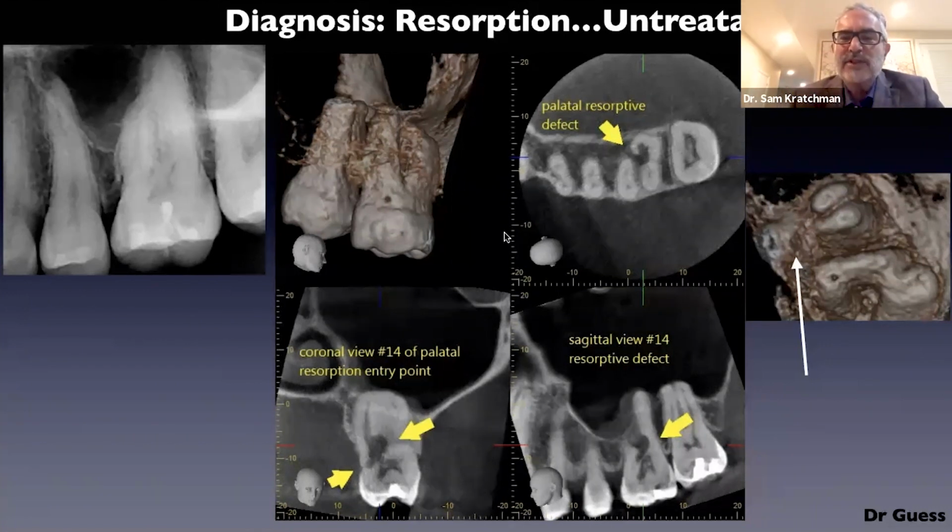You know what happens when you try to do a root canal on something like this, or look here on the sagittal view, try to do the root canal, put your file into this palatal canal, and it's just going to be bleeding like crazy, all this granulation type of tissue. If you come at a certain angle, you'll be poking out, you'll actually come out the side of the root. You can see here, to get from this part of the canal past this defect here is almost impossible. And this is actually an external defect. So unfortunately, the tooth is not even savable at something like this.